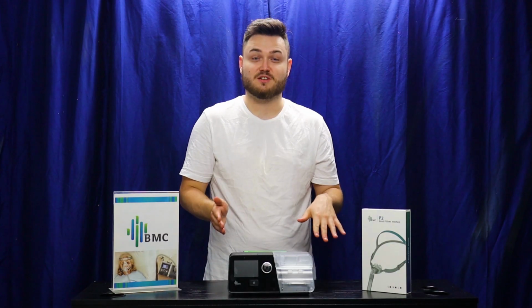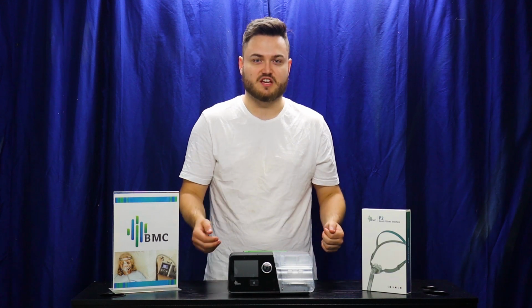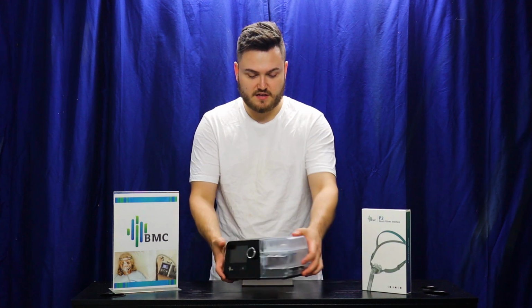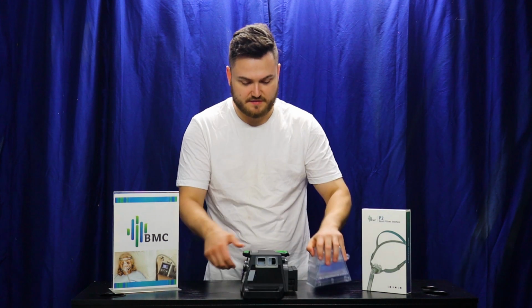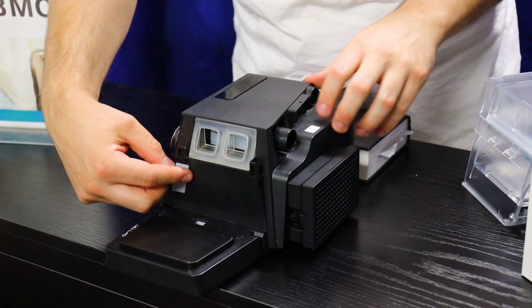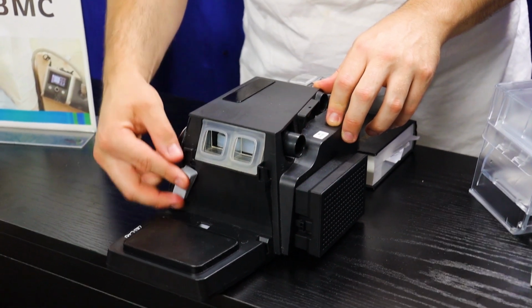While using a CPAP machine, you might need to get your sleep data taken to your doctor so that you can see how you're going and reevaluate. An SD card is included with the Luna G3, and you can locate it right next to the humidifier. Just pop the tank off, and the SD card is in this little side latch here. You can take that out, get the sleep data off of it, and take it to your doctor.